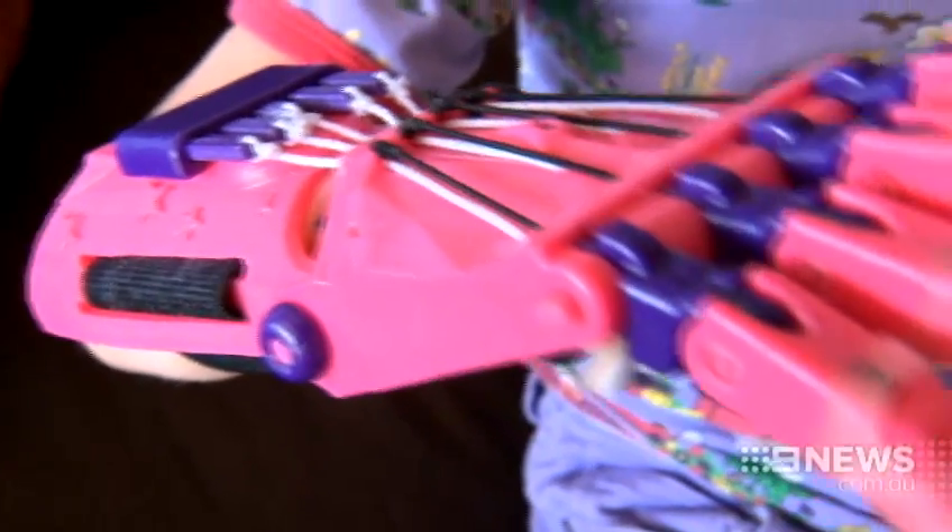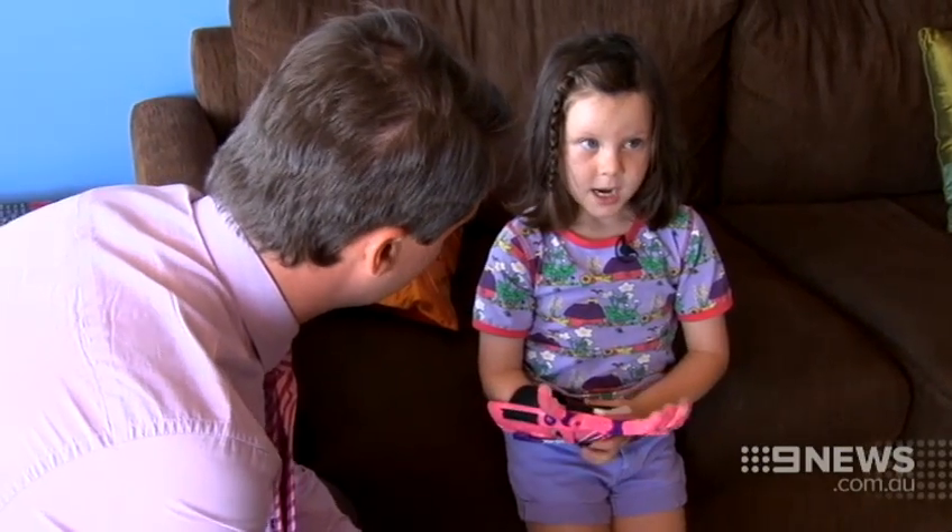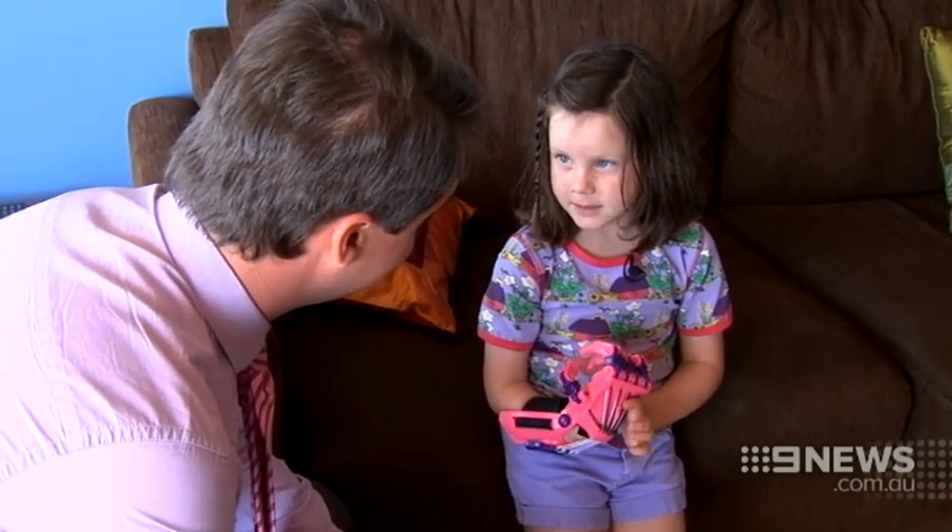Piper even chose her favourite colours. She demonstrated: "I'm just moving my little hand and it just makes it — makes it curl."